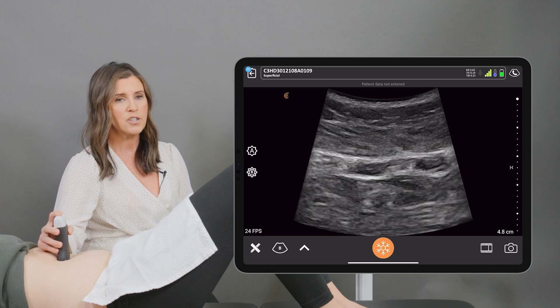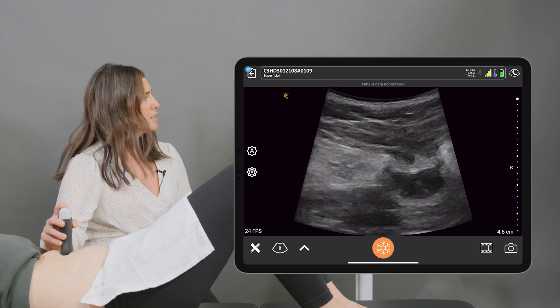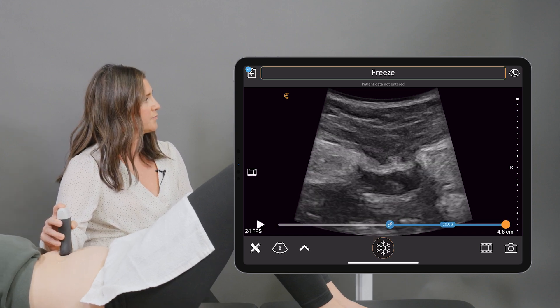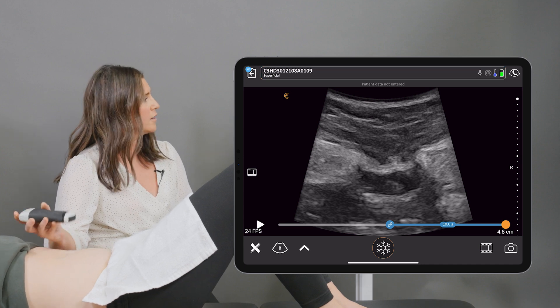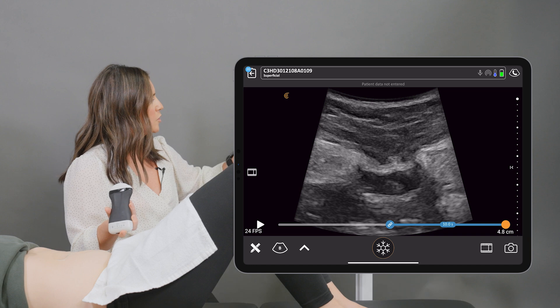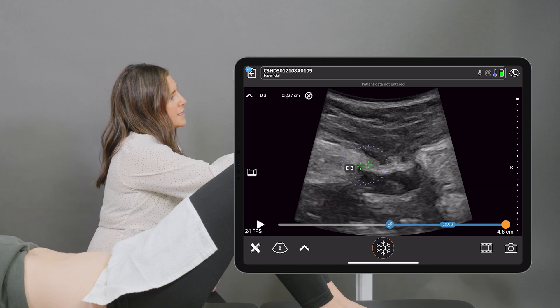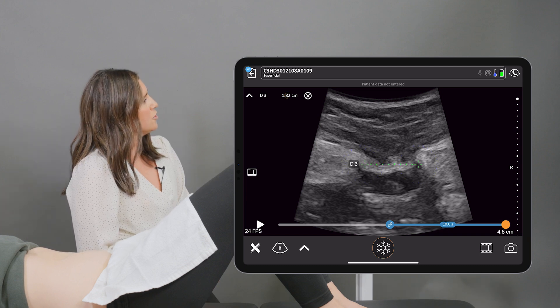I'm going to get my client to, without any cues, just do a curl-up of the head and shoulders. Then I'm going to freeze the image and get them to relax back down. At this point, we can re-measure that interrecti distance, pulling out the calipers again and measuring from one side to the other, and then capturing the image.